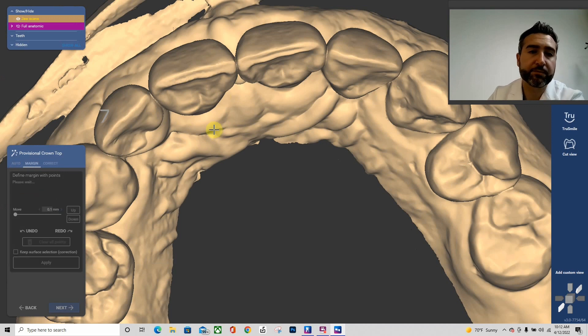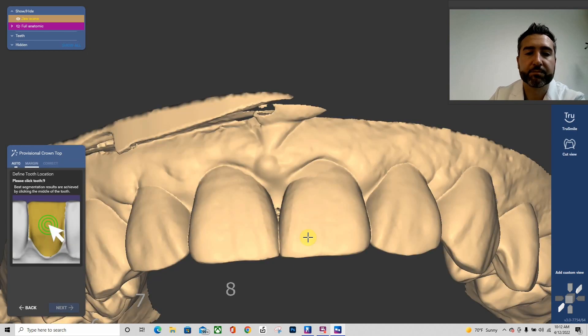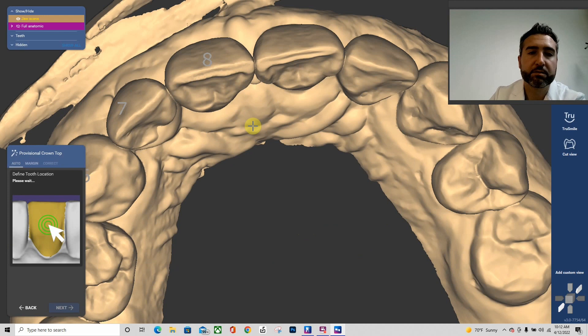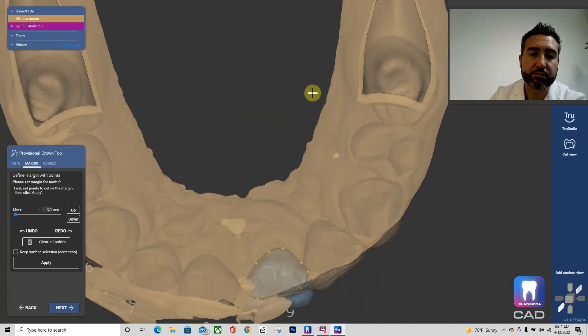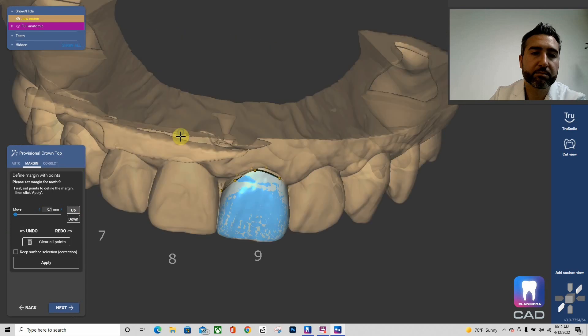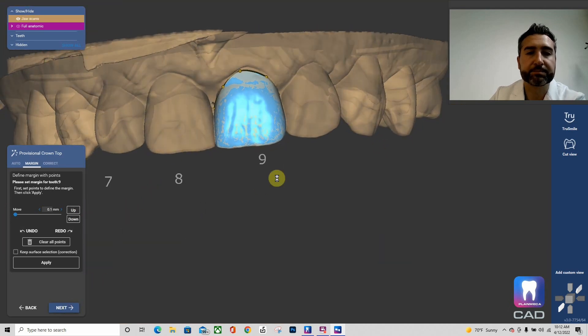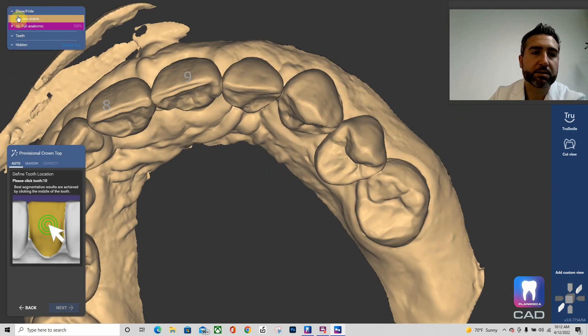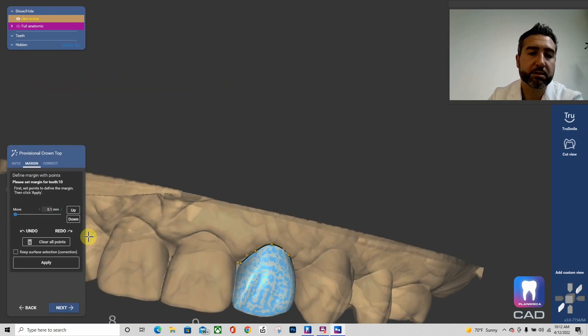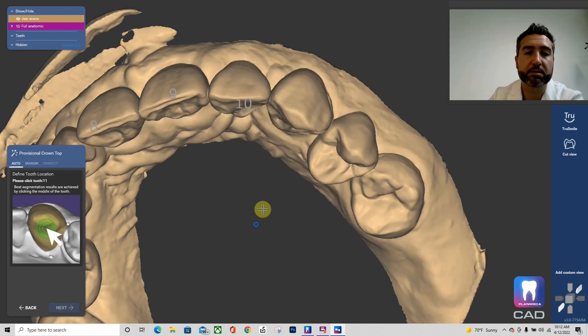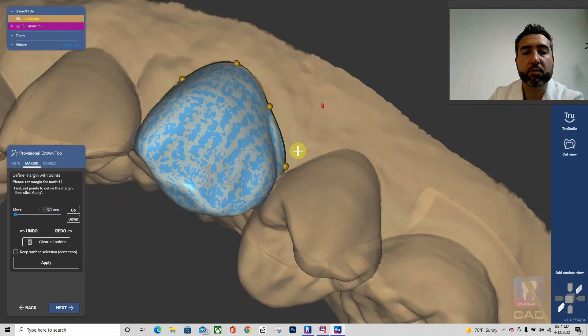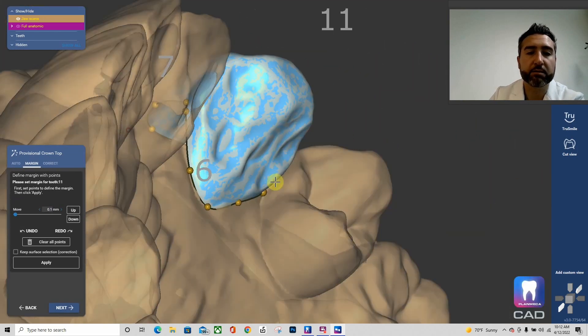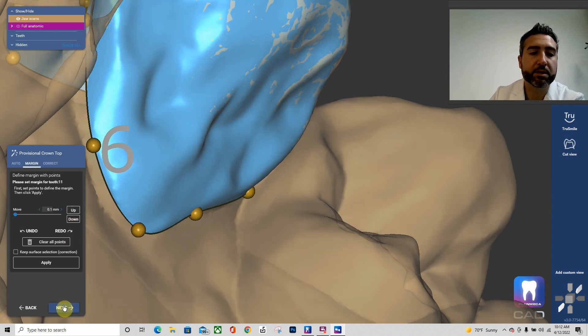I'm going to hit up here so I'm a little bit supragingival, checking to make sure nothing's folded in, and especially on the interproximal. I'm going to hide my jaw scan, add another click and bring that out. Very good. Okay, let's keep moving on. This is a super fast process usually. So once again, I'm just going to bump that up, next, click the tooth, check for folds. This actually looks really good. I'm going to bump it up one or two hundred microns. Hit next.